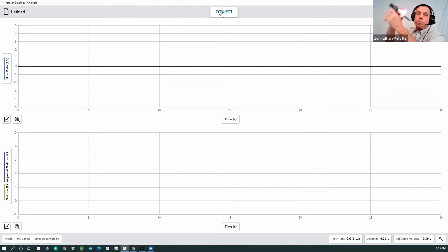The big thing is I don't want to move the spirometer back and forth, either one of them. I want to sit still while I'm breathing. So here, let me breathe. We'll see how the data comes across. Remember, 3 normal breaths, and then 1 big exhale, 1 big inhale, and then recovery breaths.